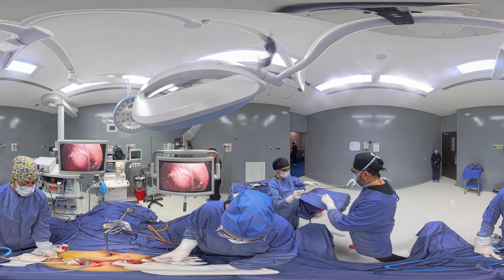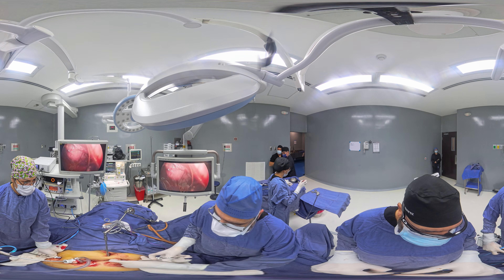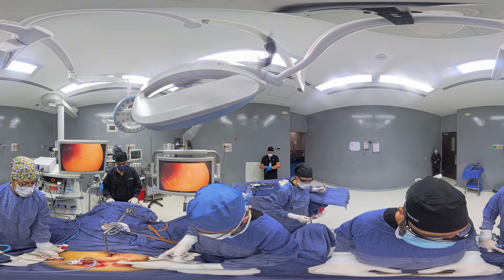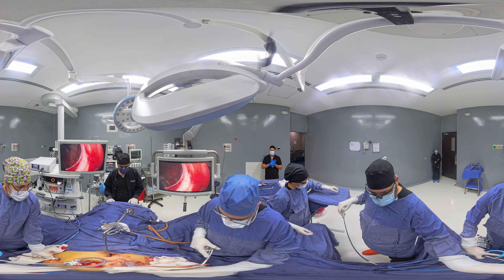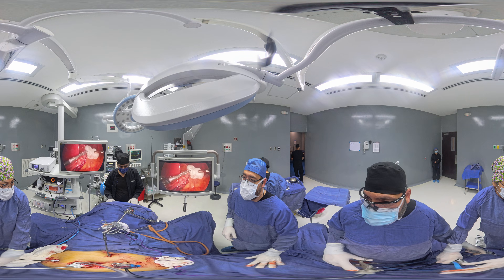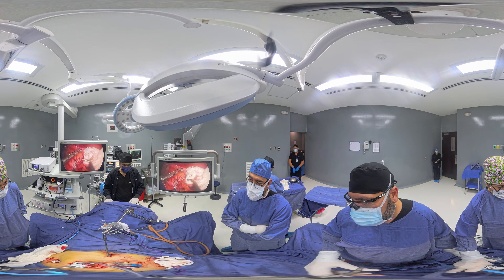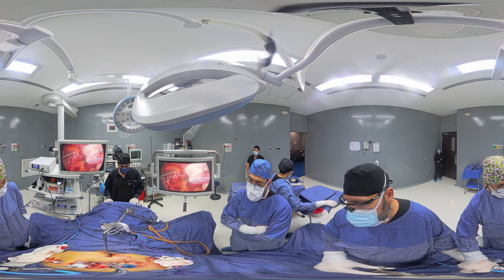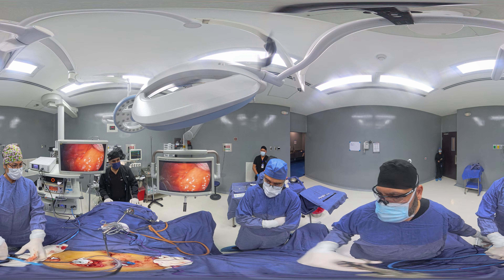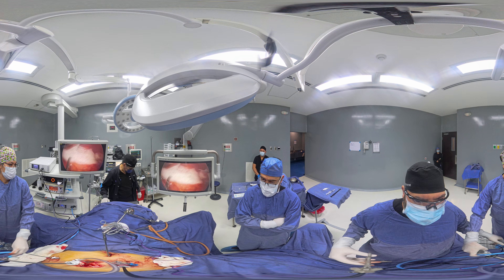All right. And here it comes — that's what we're removing from the patient, creating less stomach capacity and, of course, all the hormonal changes that will benefit this patient metabolically. We check the staple line again — nothing is bleeding. Make sure everything is nice and clean. Everything looks really good, and we remove the gauze.